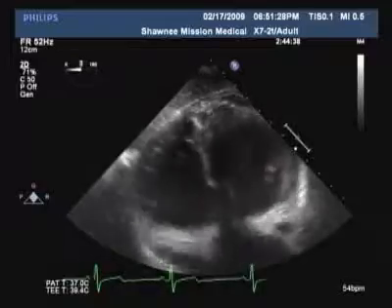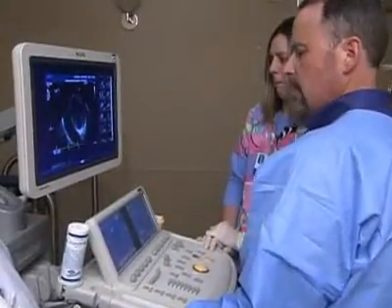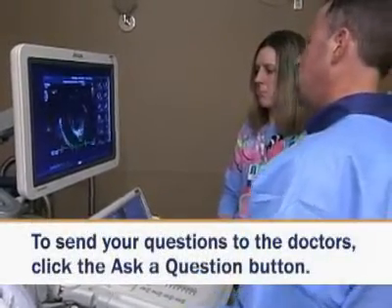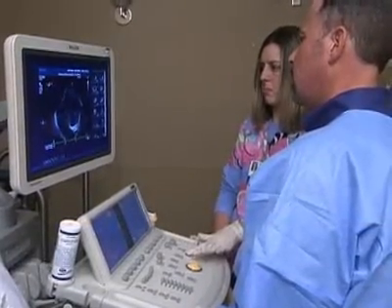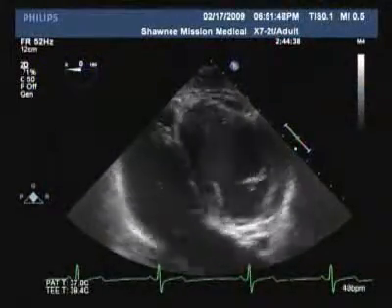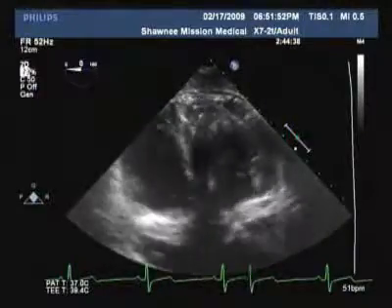That's exactly right. And if you notice, I've actually gone to a little different position here, and actually we're down in the stomach now. The esophagus basically leads food down into your stomach, and I'm actually down in the stomach now, and what we're looking at is the heart from back up. There's a circular structure on your right, and actually that's the left ventricle again, pumping blood out to the rest of the body there. And to the left of that, on the other side, the dark space is actually the right ventricle. So function of the heart is absolutely really good with this young lady.